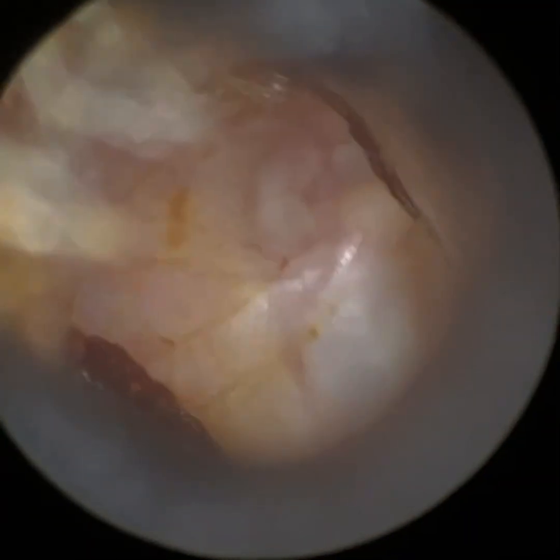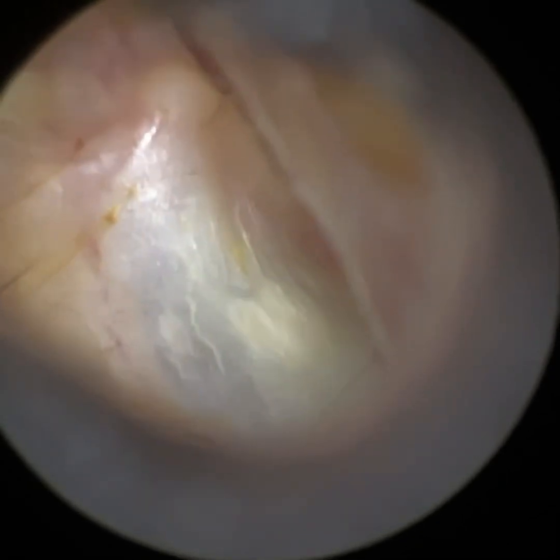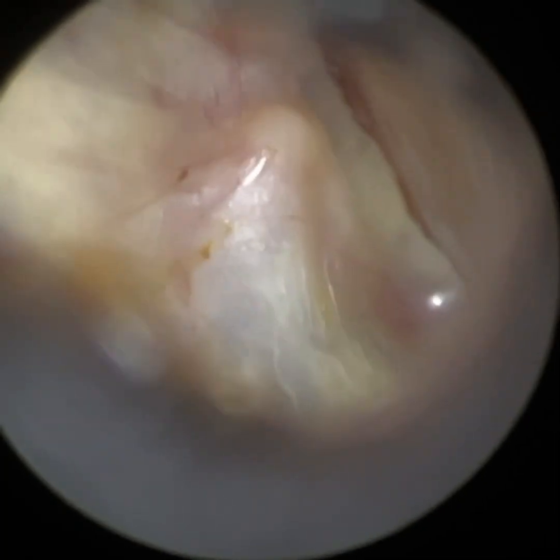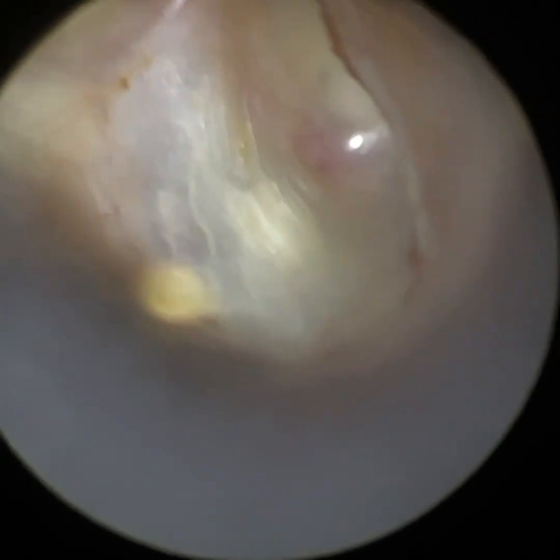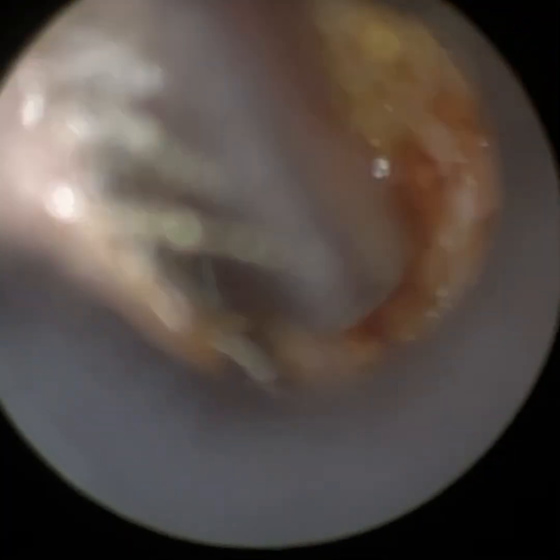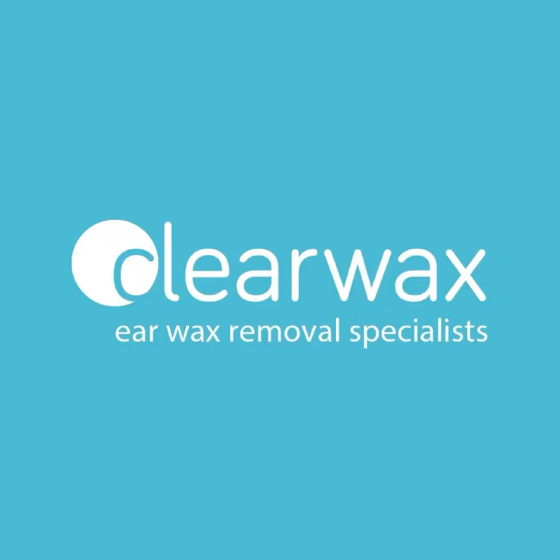I'm just going to re-enter the ear and stretch the ear wide open. You can see the eardrum there — it's slightly tympanosclerotic; they have a history of ear infections. They've got a very slight attic retraction at the top of the eardrum, but it's self-cleansing. The patient could hear significantly better. I'm just mopping up some sticky debris at the entry.